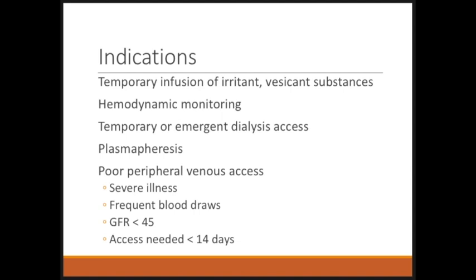It's these patients we may want to avoid a PICC line placement, since PICC lines have about a 5% DVT rate compared to only 1% DVTs in central venous catheters. If the patient doesn't need to go home with the central line, consider a CVC instead of a PICC, especially if you want to preserve their arm veins because they have chronic kidney disease for future dialysis access.